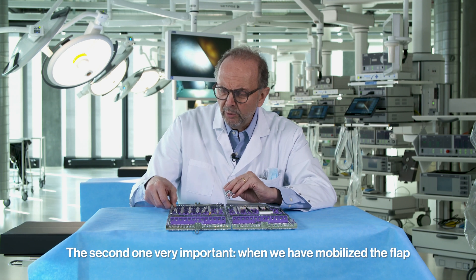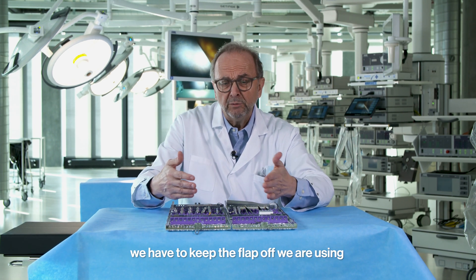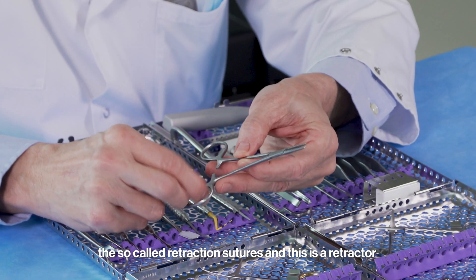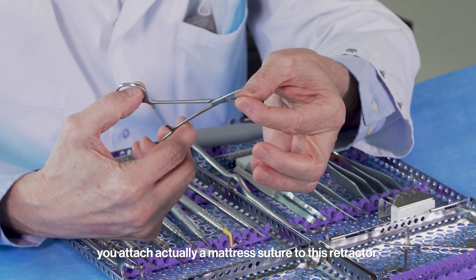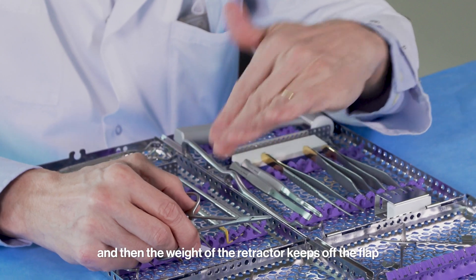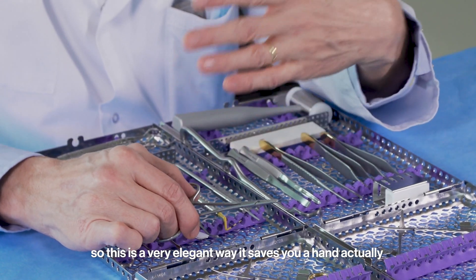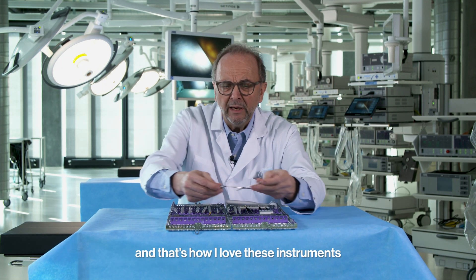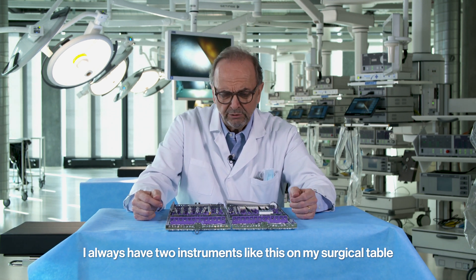A second very important instrument: when we have mobilized the flap, we have to keep the flap off. We use so-called retraction sutures. This is a retractor — you attach a mattress suture to it, and then the weight of the retractor keeps the flap off. It's a very elegant way; it saves you a hand. I always have two of these on my surgical table.